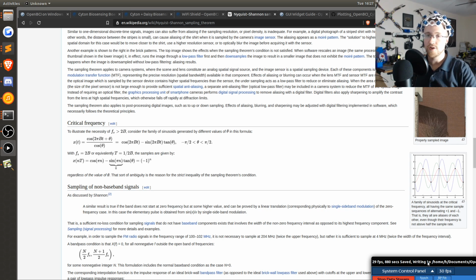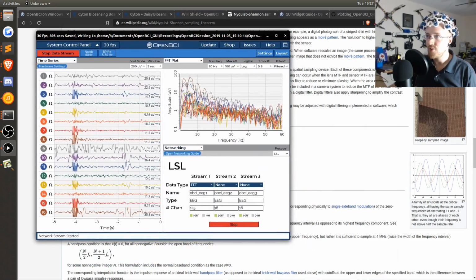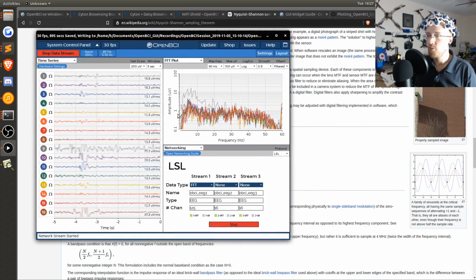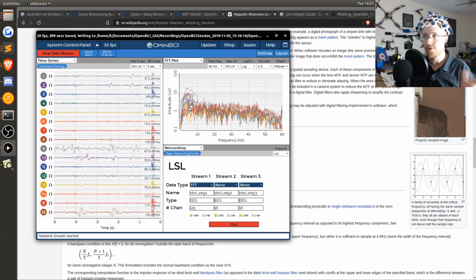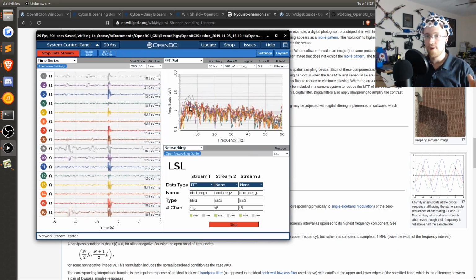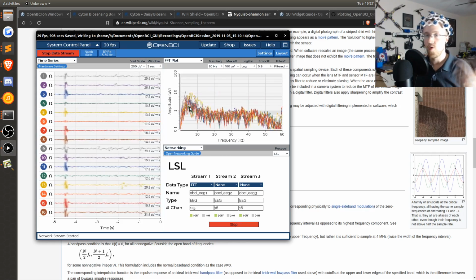Or is that fluctuation so minimal that it just doesn't matter? So I don't know. I don't have the answer to that. So instead, what I wanted was actually something made by someone who's an expert on the matter, right? And my assumption is that this FFT plot would contain useful information for the machine to determine left, right, or plausibly none.